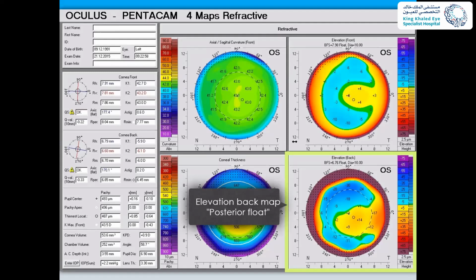Okay, question. How significant is the effect of dry eyes on Pentacam parameters? Very significant. Just today we did a Pentacam on a patient who had applanation tonometry done, and that changed its parameters. So forget about dryness. If the surface is dry, you will just get an irregular corneal surface, although compared to topography, where Placido mires are used, this is less sensitive, so you can still get it.